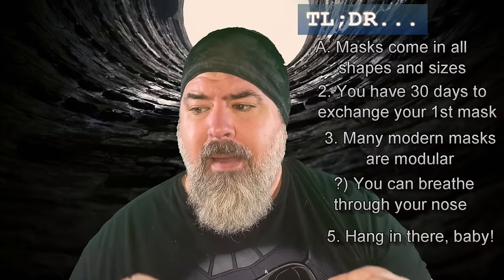Perhaps most importantly, don't give up. There are so many different kinds of masks out there. I have barely scratched the surface here, and I'm mostly sticking to the Philips Dreamwear and the ResMed masks because they're the most common, they're the easiest to find, generally the most affordable too. But there are so many different kinds of masks. There are masks with memory foam instead of silicone. A little harder to clean, you have to replace them a little more. That's all that works for some people.